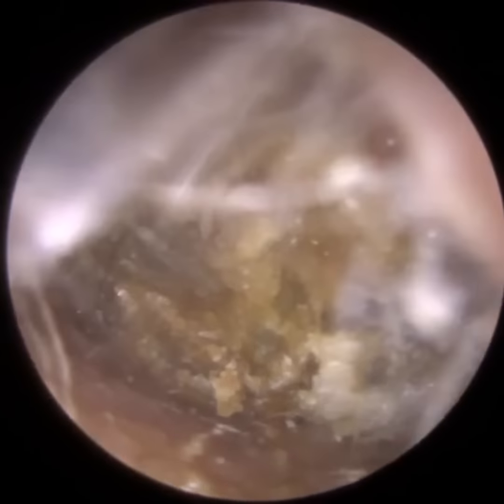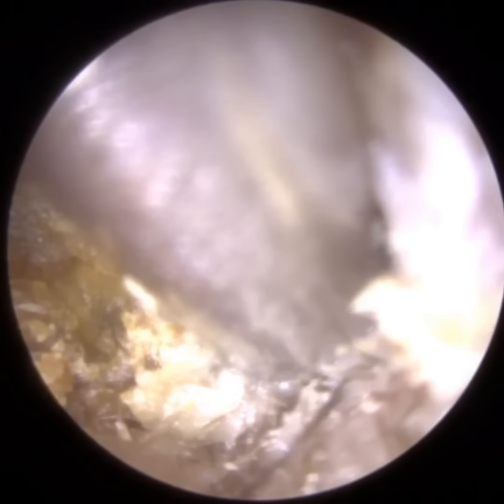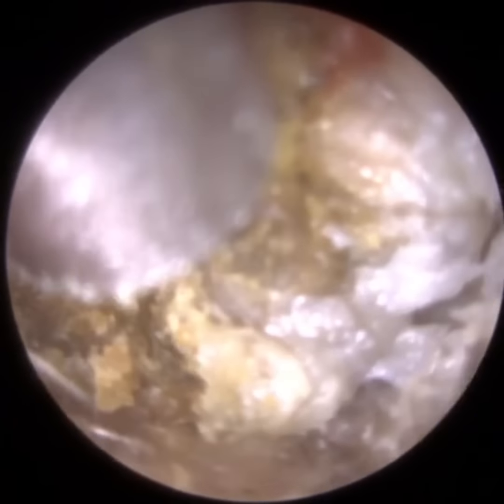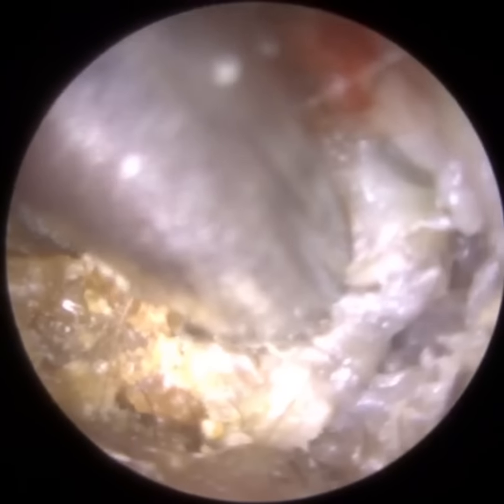Nonetheless, it did help me to perform microsuction still, because it's almost decompressing this plug. This plug has got so much compression, just by slicing through the core of it, it relaxes the plug of skin, and it does help with microsuction. I'm just going back to the suction.